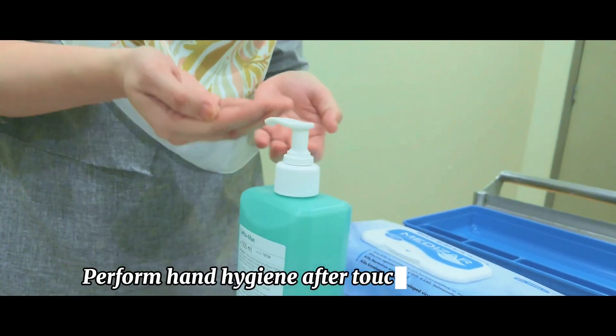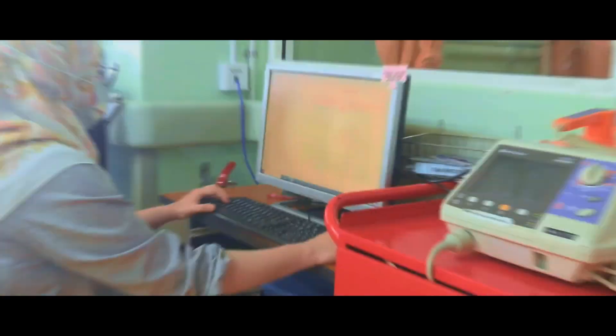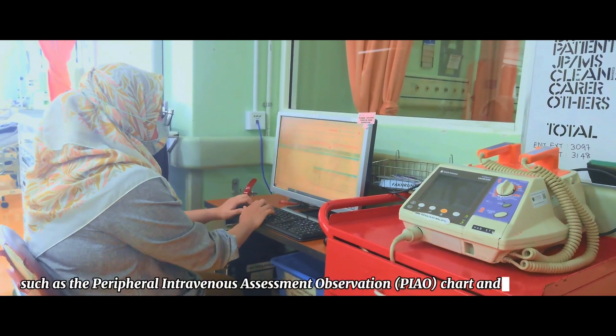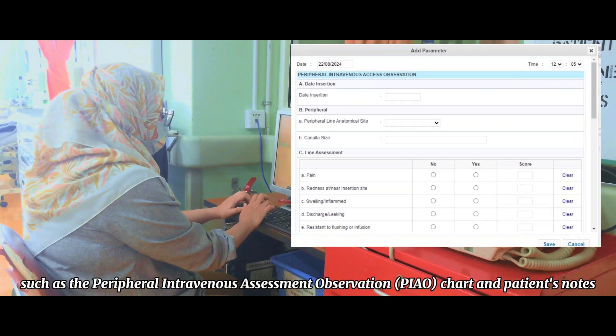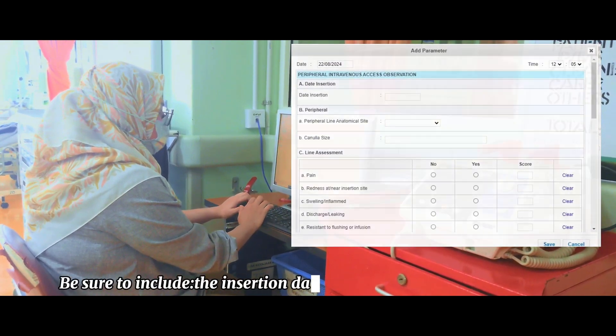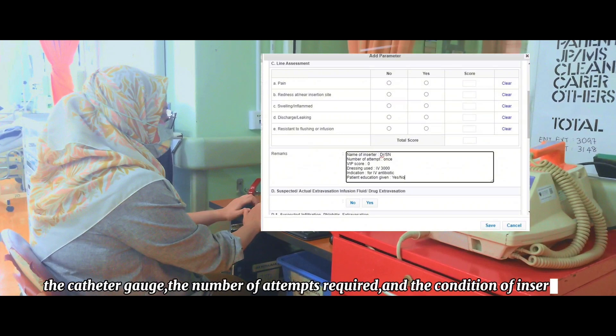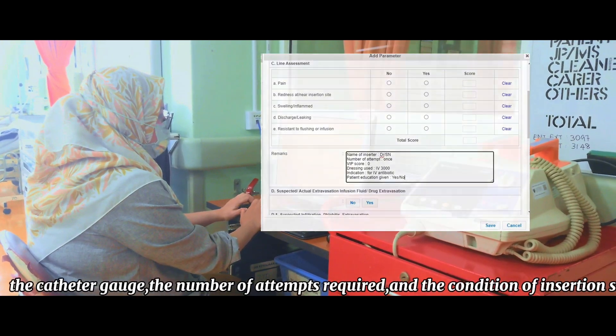Perform hand hygiene after touching the patient. Document the procedure in the insertion chart, such as the Peripheral Intravenous Access Observation (PIAO) chart and the patient's notes. Be sure to include the insertion date and time, the site of insertion, the catheter gauge, the number of attempts required, and the condition of the insertion site.